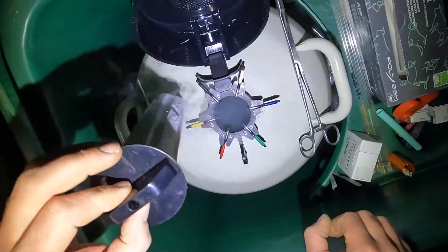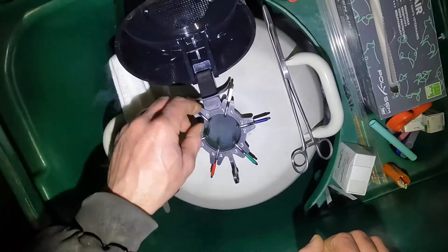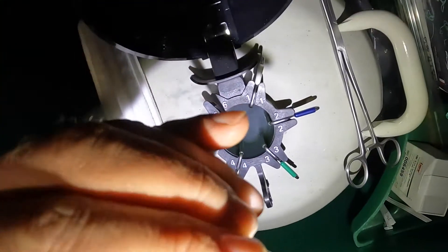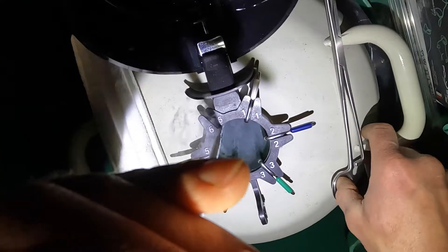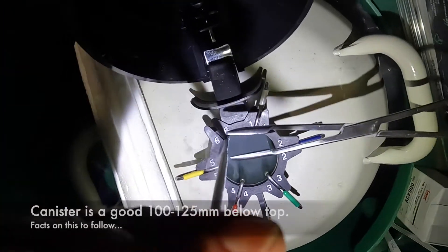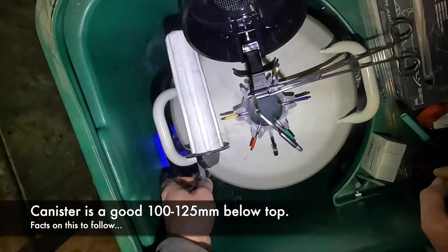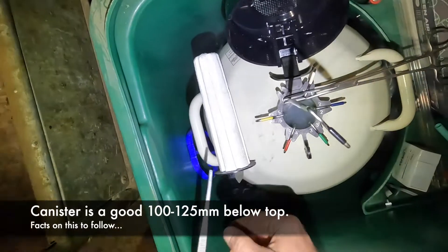I'll remove my bung. I will lift the canister I want to be delivering into — hopefully you can see — and I'll only just bring it into the neck of the flask, so it's well down below the frost line and still in a good vapor to keep my straws correct.